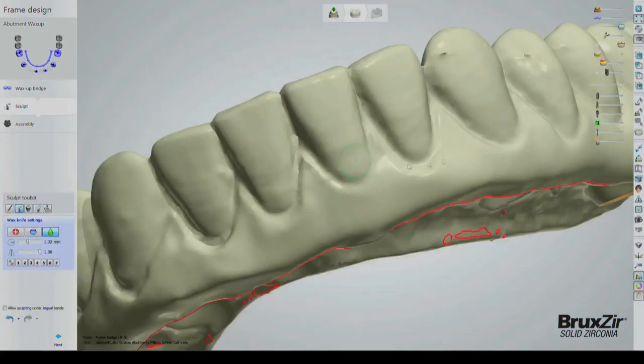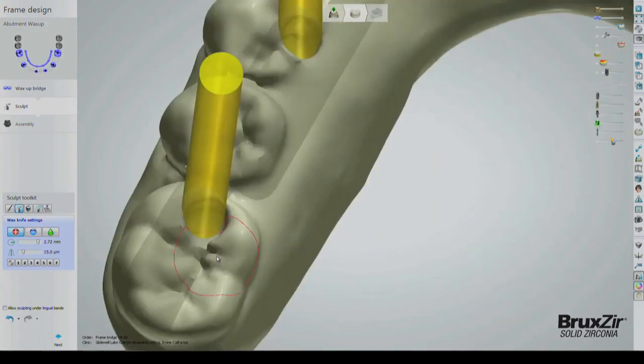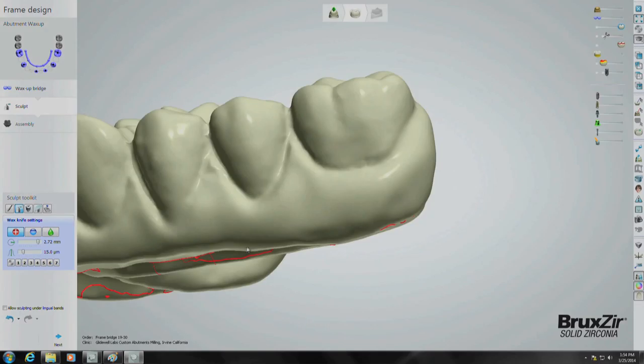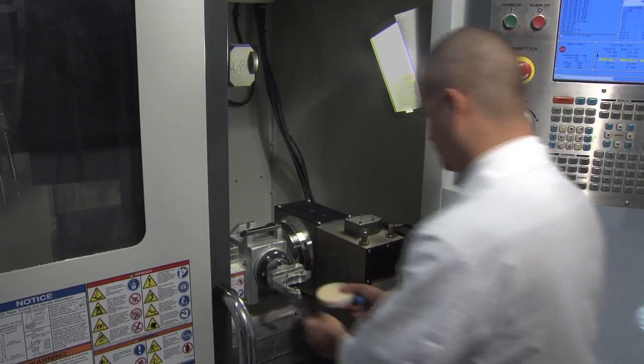Next, CAD software is used to fine-tune the prosthetic design, including occlusal contacts, incisal edges, gingival margins, and the access holes where the titanium inserts will be placed. The prosthesis is digitally readied for fabrication and is then milled from a block of PMMA.